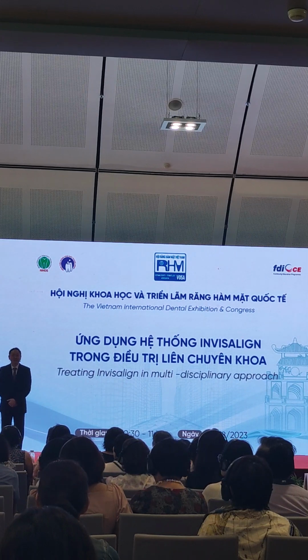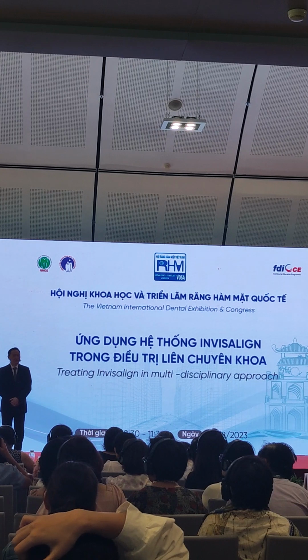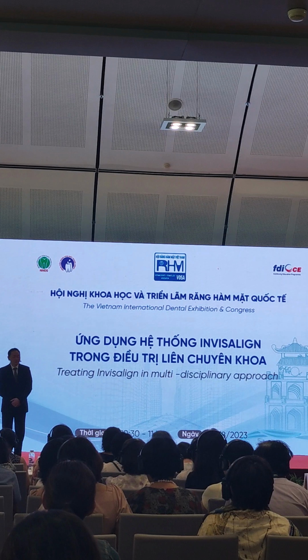Doctor, I have a question about your earlier presentation. You see that when you extract the fours and you retract, there is not a lot of loss of anchorage. So we want to ask, what is the average loss of anchorage that you see in your cases?